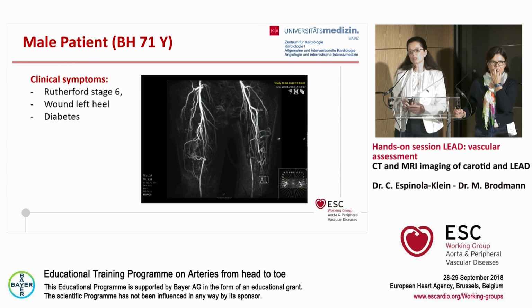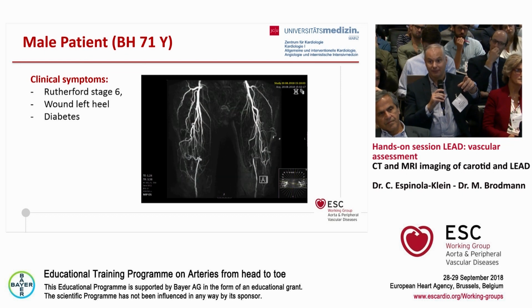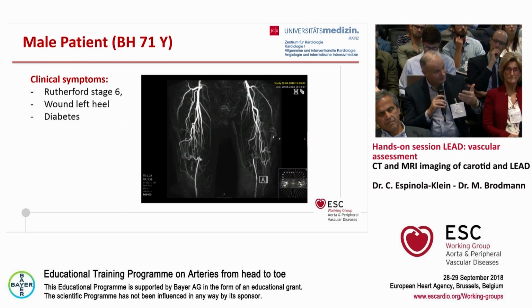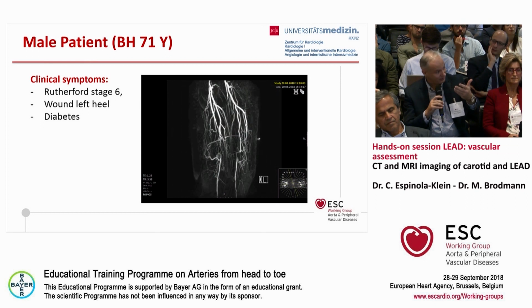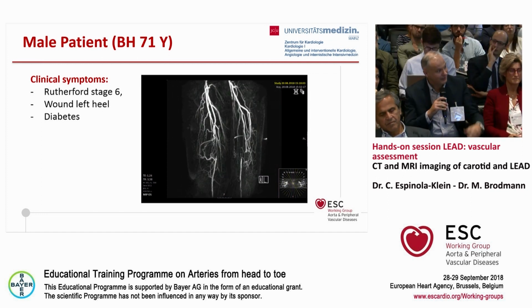I think we should, if we have the possibility, go with the guidelines. Yeah, luckily for these patients, this one is a typical diabetic patient. Usually we have, that's one. And we had to estimate below the knee distal lesions because of the runoff. Yeah. So it's crucial to have the information about this. Right. And especially for the surgery, for the endovascular, for the patency of the graft, and all of these things. So we need it.